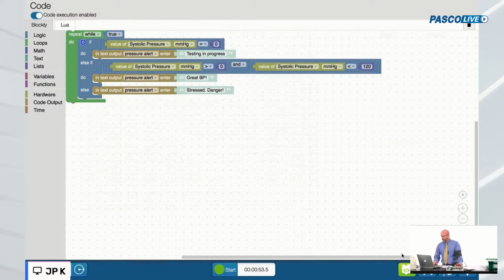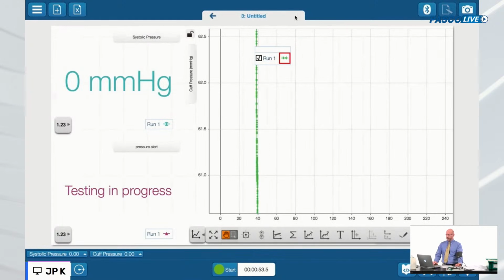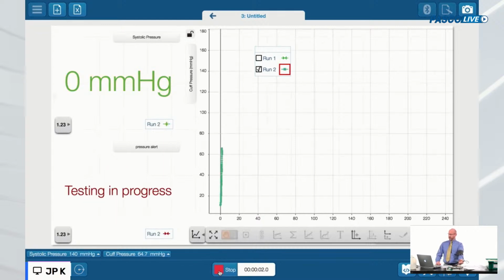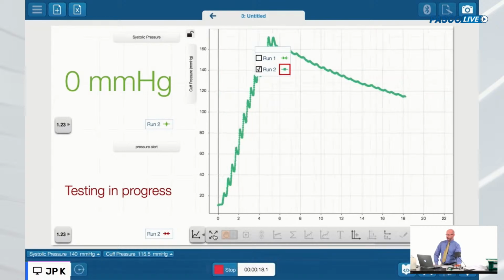So this is what the screen looks like then. I'm going to go to the screen that I designed that tells me those things. See, it has my high blood pressure. It tells me testing in progress. We're going to try it again. And hopefully I'm going to pump up my sphygmomanometer and let that pressure come down. Again, watch the screen. Watch how wonderful it is that we're looking at this data. I'll try and be a little bit more quiet here as it's measuring. Let me spread that out so you can actually see my heart beating here. Look at that.